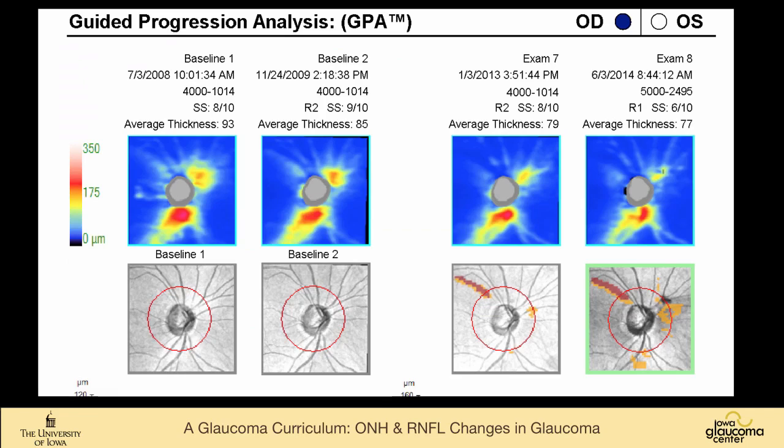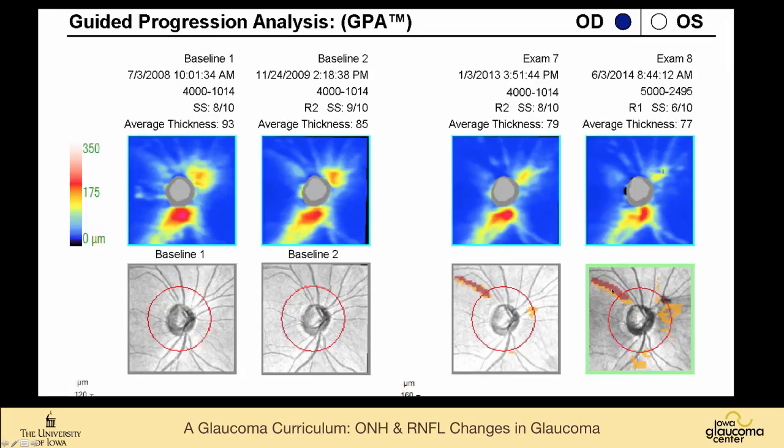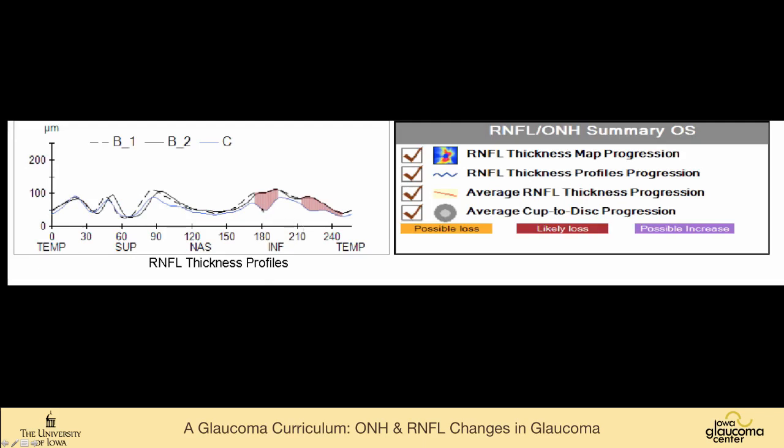There is now progression analysis that can be used to show that this patient is losing superior nerve fiber layer over the course of time. And there are many other statistical ways of looking at this: the average retinal nerve fiber layer thickness, the cup to disc ratio, etc. You can see here filled in areas where there is significant change in the retinal nerve fiber layer thickness profiles. So I won't get too much in detail about how to interpret an OCT.